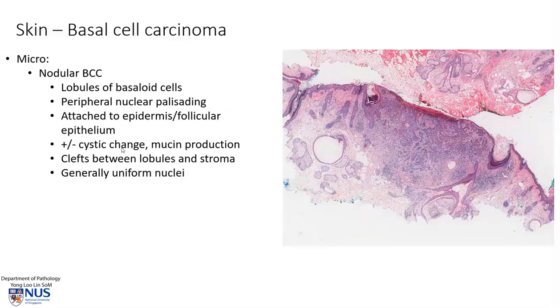There may be sometimes cystic change and mucin production, which we also saw. And we may see clefts between the lobules and stroma — again, we saw this earlier. Generally, the nuclei are relatively uniform.